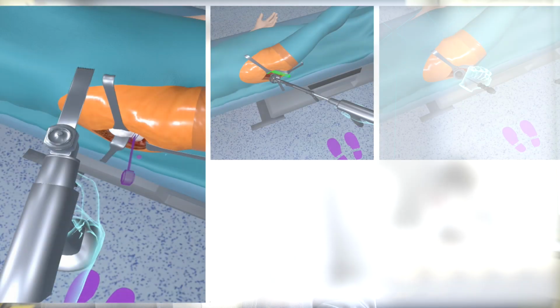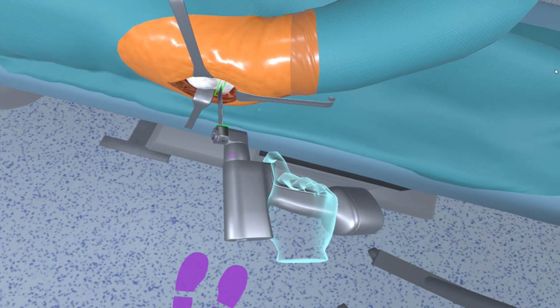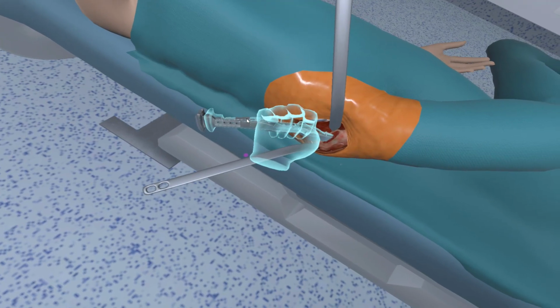One of our tasks at the Chemnitz University of Technology was to work together with our clinical partners to first of all record the material parameters for our 5 steps. This would first be removing the femoral head, followed by hollowing out the acetabulum. The third step consists of the new artificial acetabulum being fitted into place. The fourth step involves the reaming of the femur, so that in the fifth and final step, the implant can then be fixated.